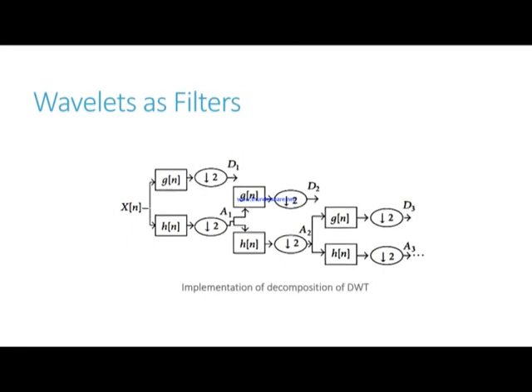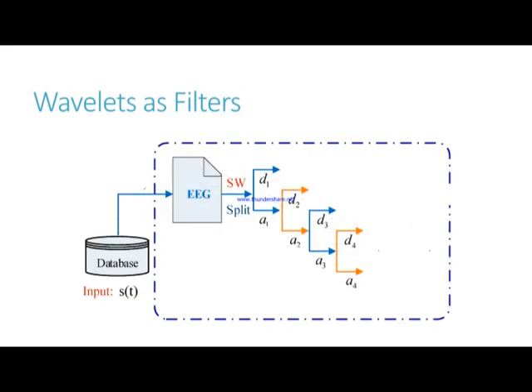The number of levels to which the wavelet decomposes is chosen depending on the component of the EEG data with dominant frequency. A good example of how to use wavelet transform as bandpass filters in EEG feature extraction can be seen here. Wavelet transforms divide the EEG signal into small segments. Each segment is taken as a frequency band. That segment of frequency band can be considered as a stationary signal. The discrete wavelet transform divides the signal at different frequency bands by decomposing the signal into detail and approximation coefficient information, passing through high pass and low pass filters.